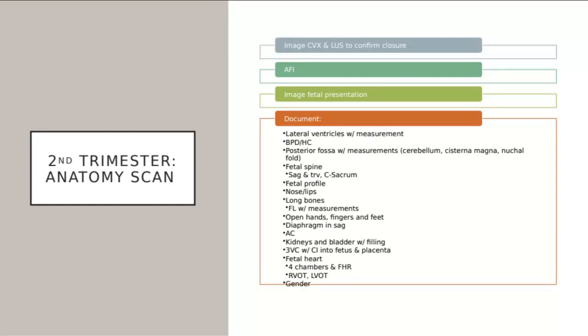And sometimes those cartilage centers or those epiphyseal centers are going to look a little bit like they're part of the femur bone, but they're actually not. So we're going to go over that a little bit as well.